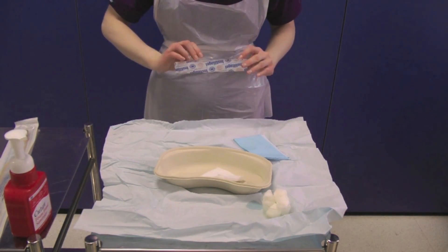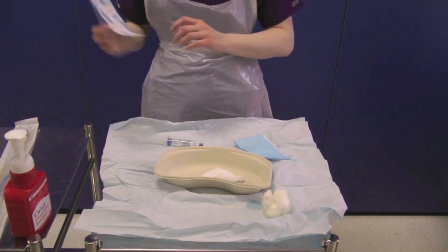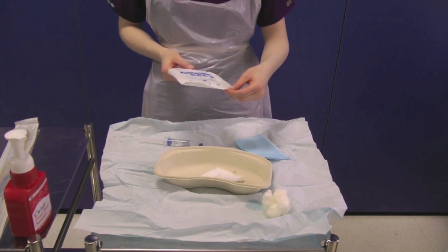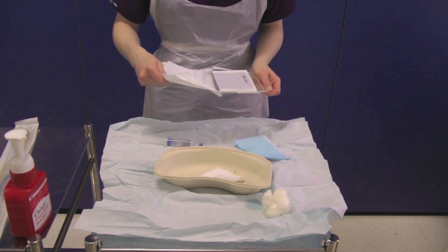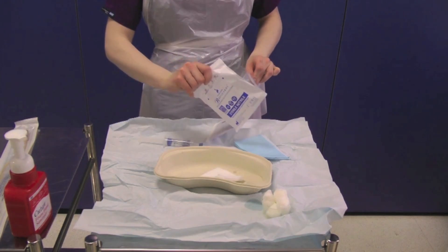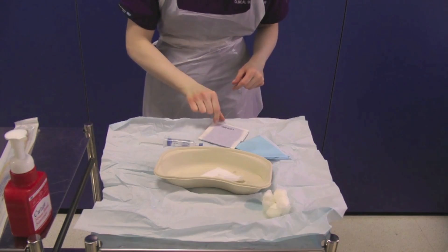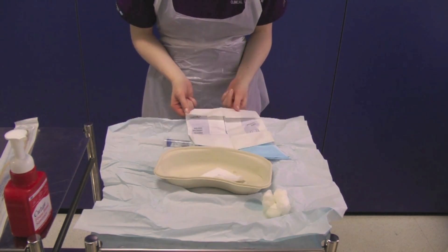Open the outer packaging of the prescribed Instillagel and drop the syringe onto the sterile field. Then open the sterile gloves and drop the internal packet onto the sterile field. You must now decontaminate your hands as you have been touching outer packaging. Carefully open the sterile wrapping, ensuring you do not touch the sterile field, and put the gloves on.